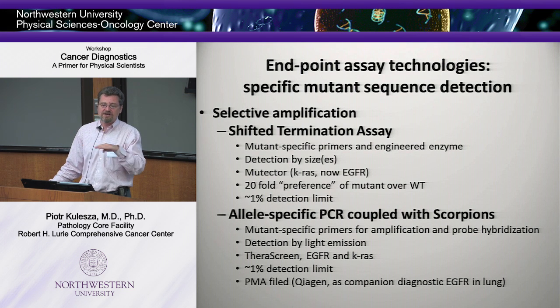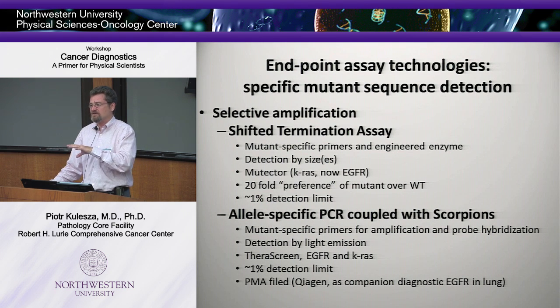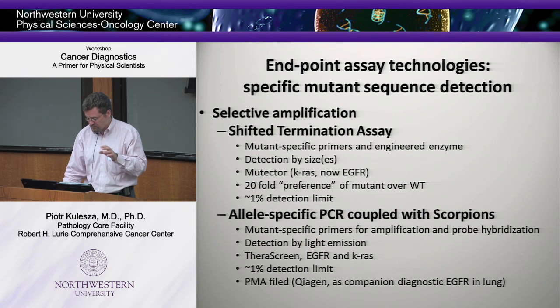We operate in a CLIA environment. We have to operate in a very regulated way. Some of these assays take 2.5 years of massive amounts of money and work to get to market, and this is what we have to contend with. So we have to be very mindful about how we analyze this tissue and what we put in there.